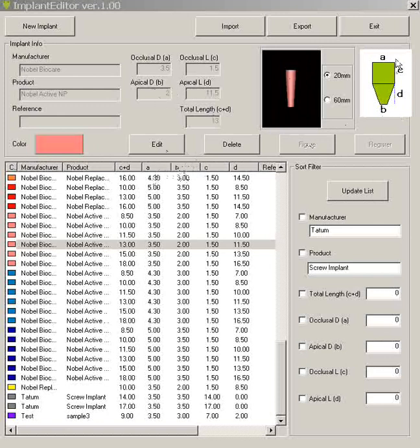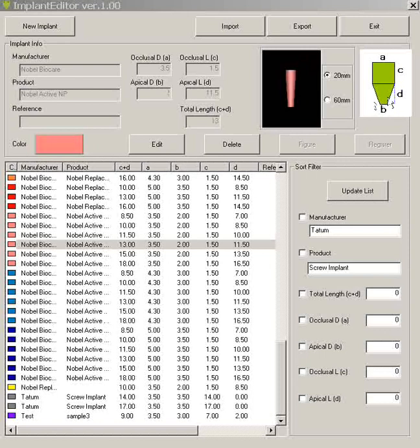C is the occlusal length. Occlusal length here and here and here. And D would be the apical length. Apical length here, D and here and D.